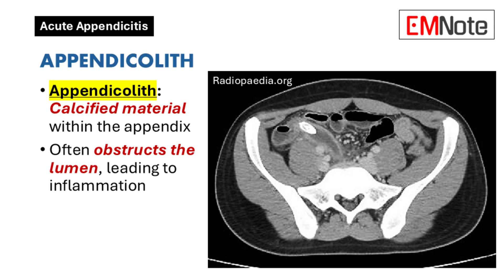Presence of appendicolith: The identification of an appendicolith — calcified material within the appendix — can support the diagnosis, as it often obstructs the lumen, leading to inflammation.